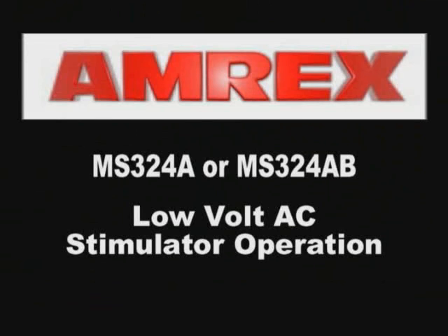MS-324A or MS-324AB Low-Volt AC Stimulator Operation.